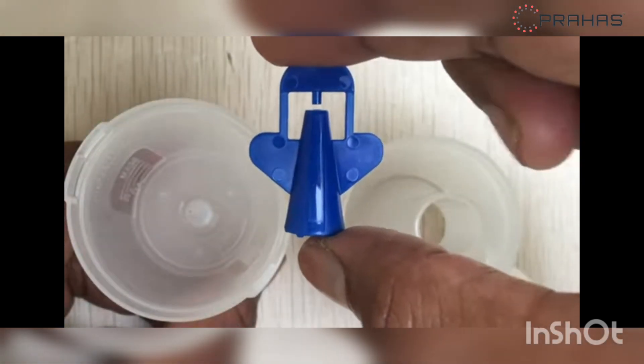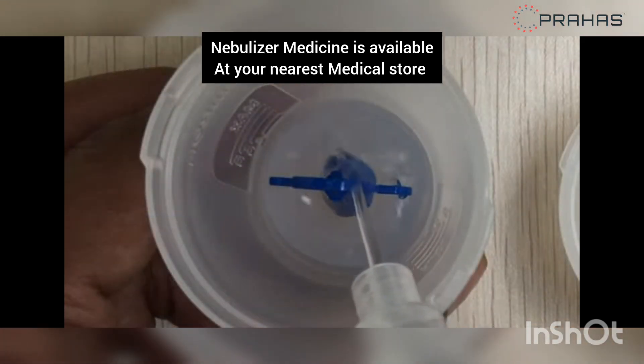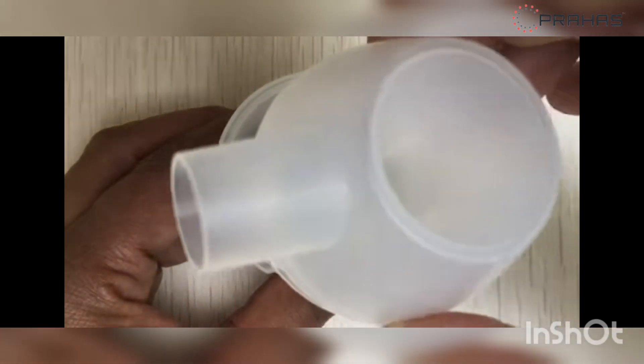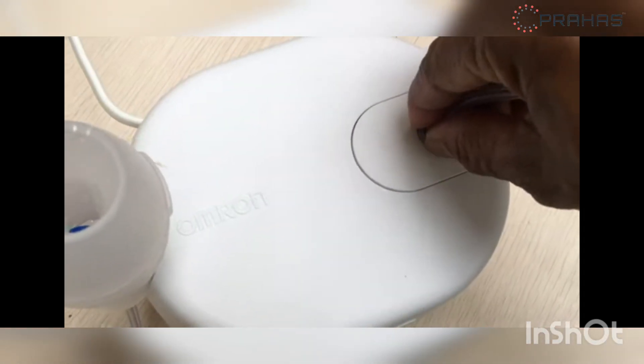Make sure the vaporizer head is placed inside the tank and add correct amount of prescribed medication. Put the inhalation top back onto the medication tank. Attach other end of the tube to compressor firmly.